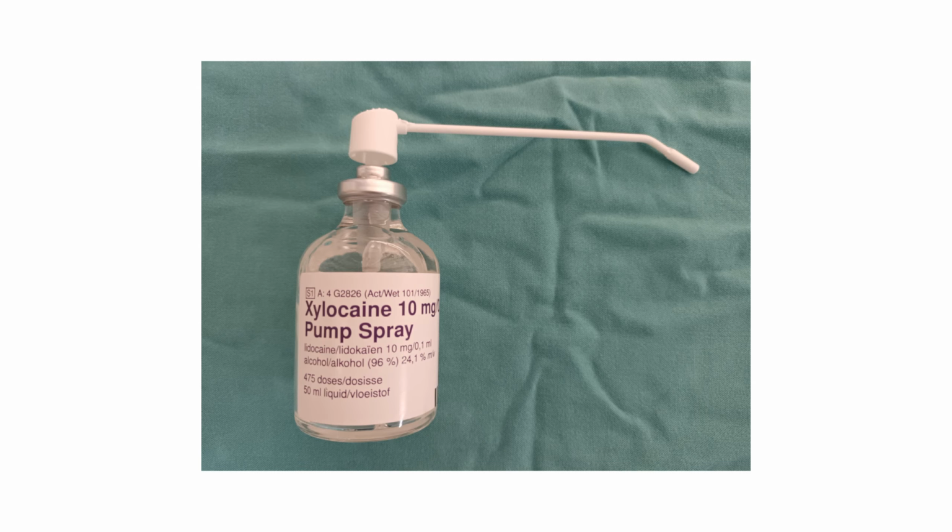One can then, with the patient supine in a ramped position, start to insert the video laryngoscope, again using the D blade. And I will have a xylocaine spray in my right hand and the video laryngoscope in my left hand. The xylocaine spray is a 10% spray, and each spray delivers 10 milligrams of lignocaine. And so as I'm slowly advancing the video laryngoscope into the airway, if the patient has any discomfort, I can slow down, I can bring the laryngoscope further back, and I can spray 1 or 2 sprays of xylocaine in that area, wait a little bit, and then advance the video laryngoscope further.